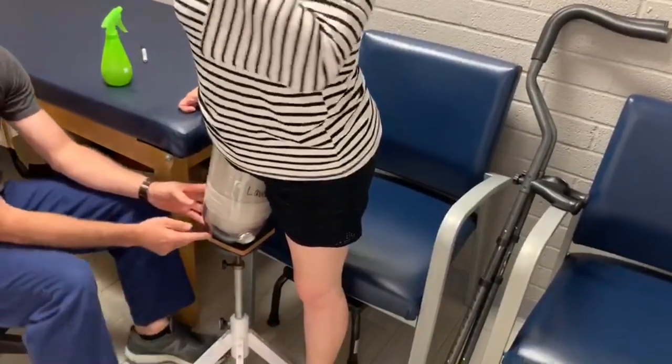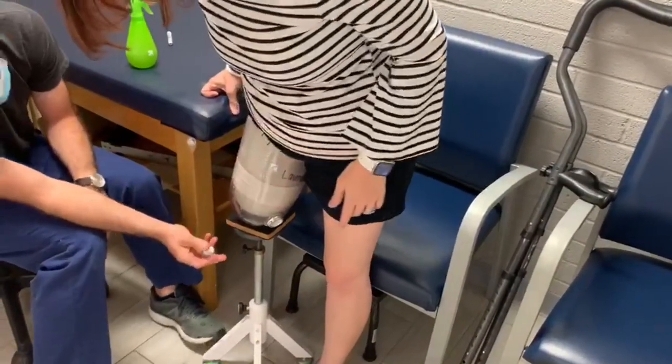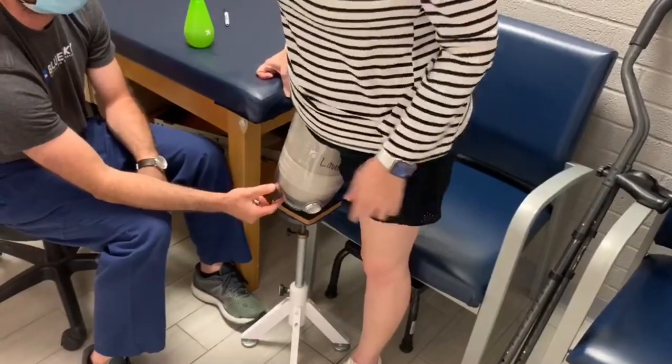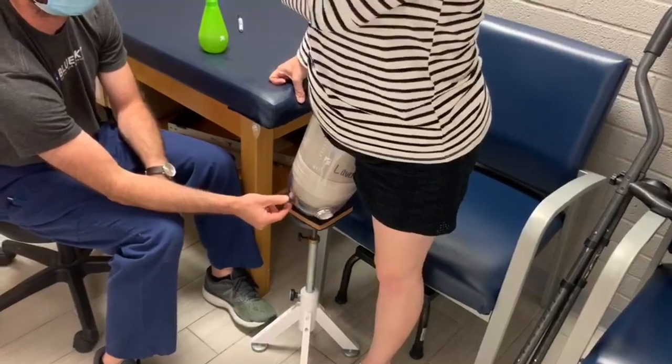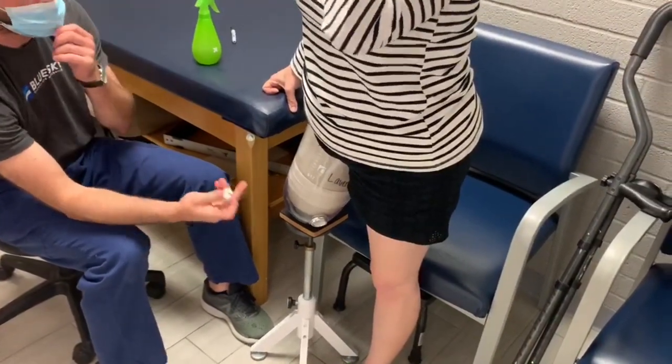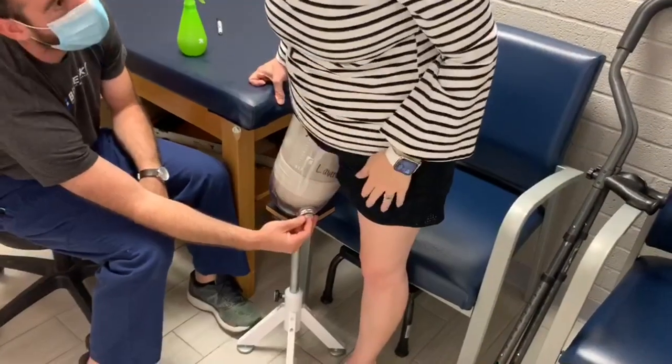Now I don't know if you can see there's a little bit of a space down here. You see you're not all the way at the bottom? Right now that's too far. Eventually it'll be a little bit less. I like you to be about a half inch to a quarter inch from the bottom. But then that's where this comes in. You're not fully in it yet.